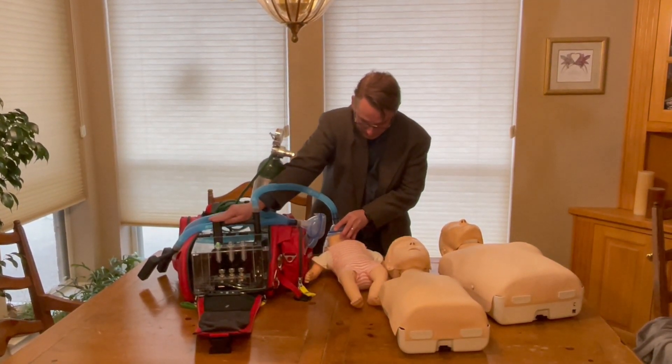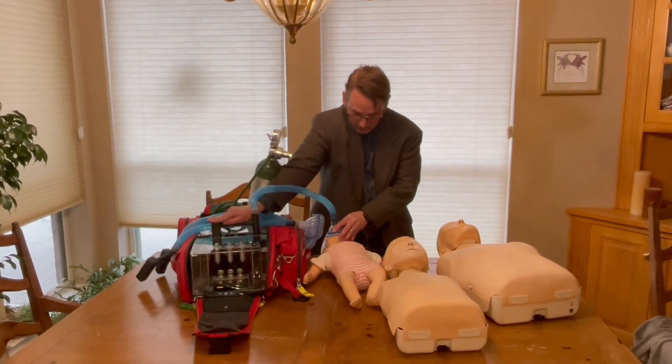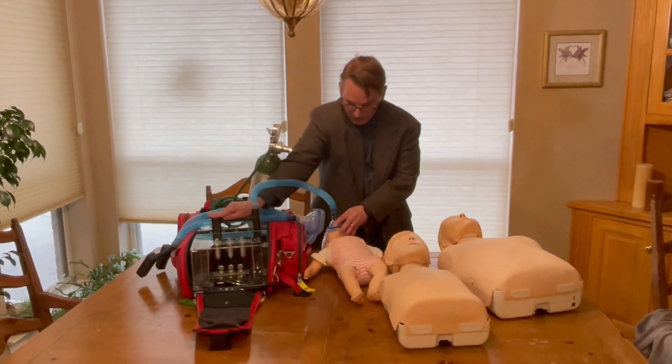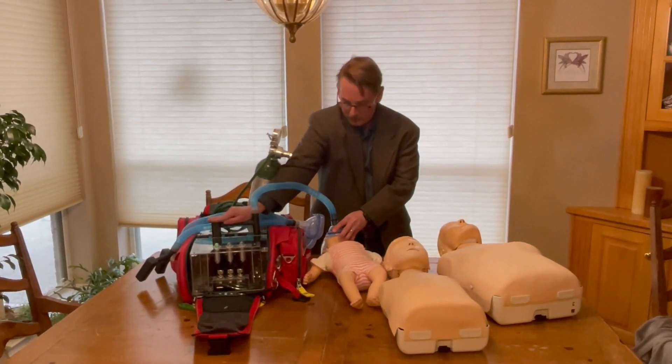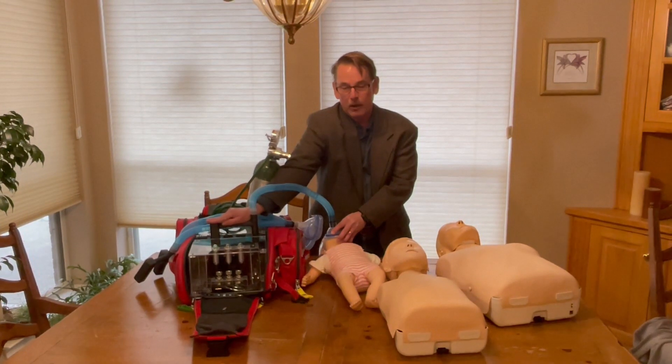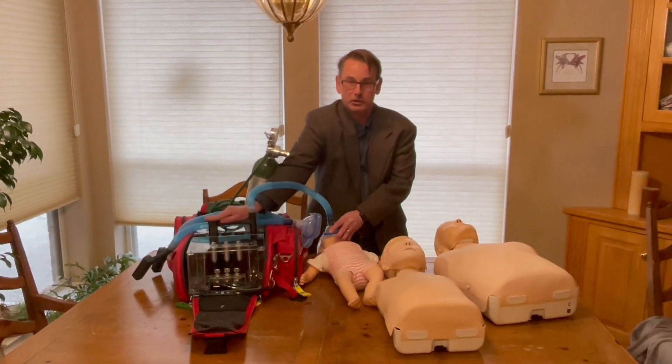We just turn it on and you can see the little chest going up and down. That's at a tidal volume of 100 cc, a respiratory rate of about 30 breaths per minute — the rescue breath given over one second with one second for passive exhalation, at an oxygen concentration of 100%.